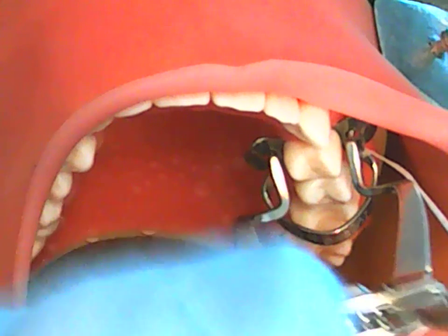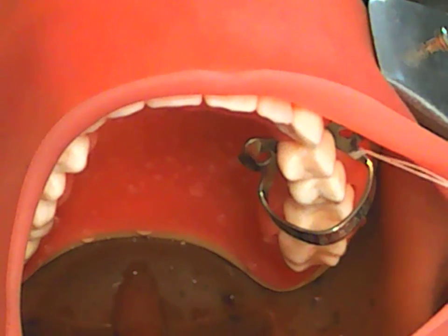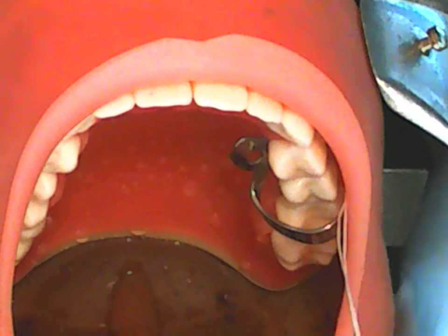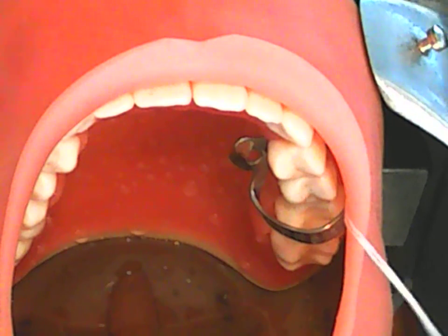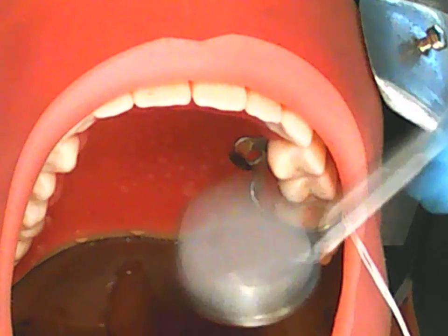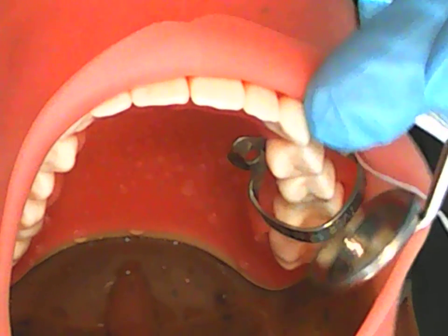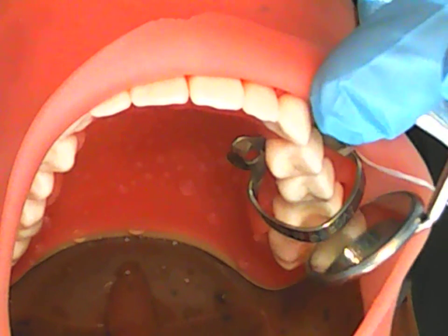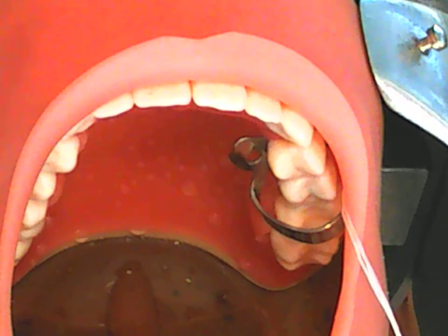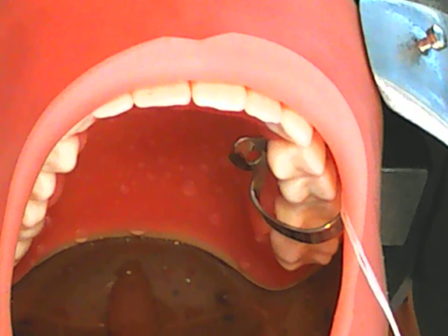They're anesthetized in this area, so you don't need to worry too much. You want to ensure that the tissue is not being impinged though. So I release my forceps. I'm going to just have this floss out the side so I know where it is at all times. I'm putting my forceps down, using indirect vision to check clamp placement. What I'm checking is that the prongs are not impinging the tissue, and they look like they're fine. They're over the height of contour and sitting near the sulcus.